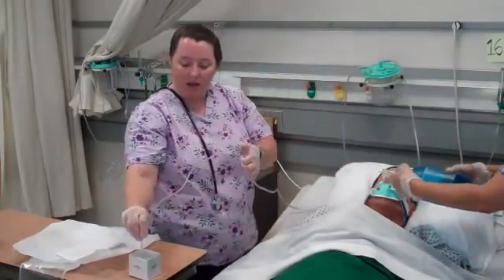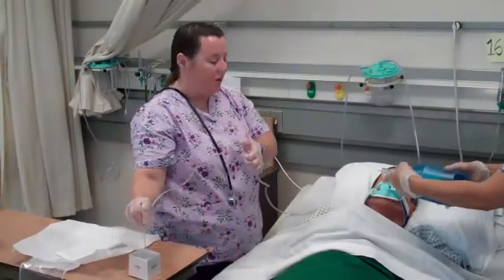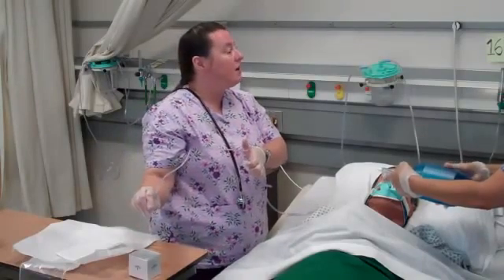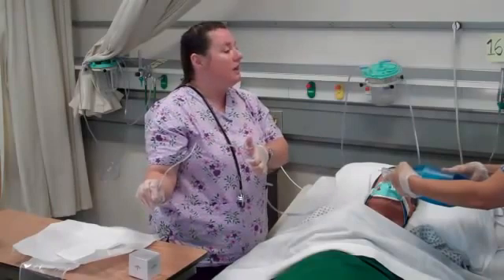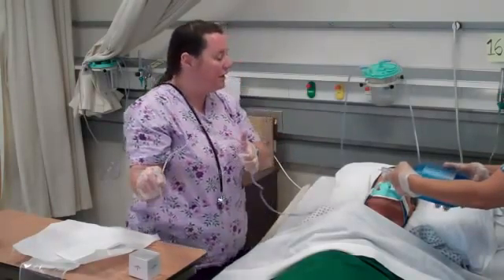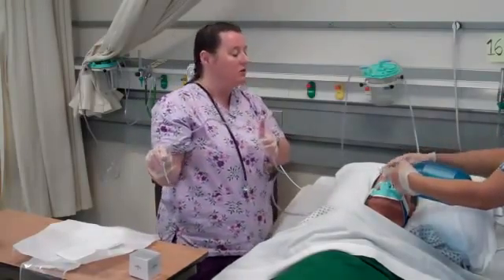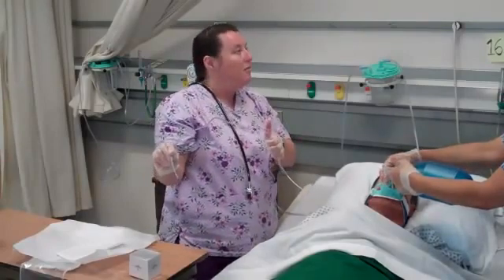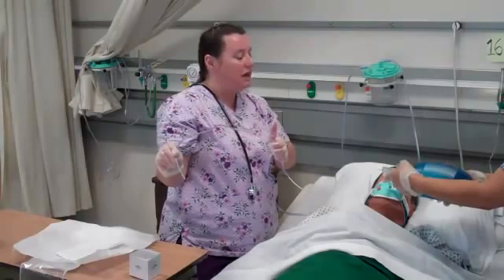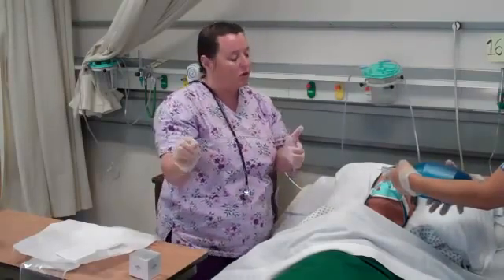Maintaining sterile technique, I'm going to clear my tubing and reassess my patient. I check the monitor to see if oxygen saturation has come up, if heart rate has returned to baseline, and whether any arrhythmias are present. If arrhythmias were stimulated I would stop the procedure. The O2 sat has come up slightly but hasn't returned to his normal saturation yet, so his condition appears to warrant a second pass.